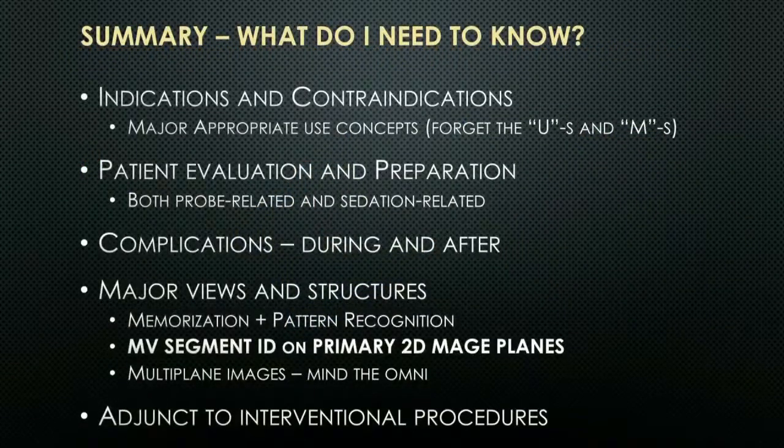So, in summary, what do I need to know for the exam? You need to know indications and contraindications. You need to know the major appropriate use concepts. Don't focus on the uncertain appropriateness or the maybe appropriates. Focus on the A's and the I's, the definitely appropriate and the definitely inappropriate. There will be questions on patient evaluation and preparation, as well as complications that are both probe-related and sedation-related.